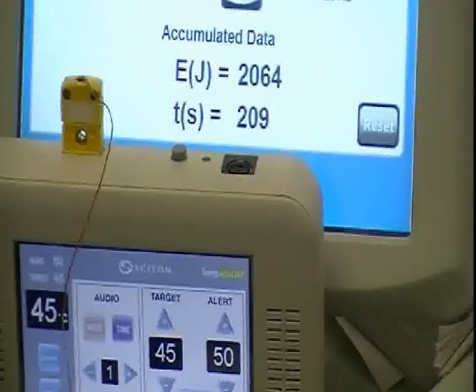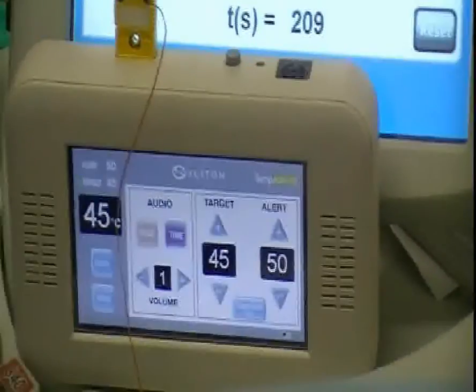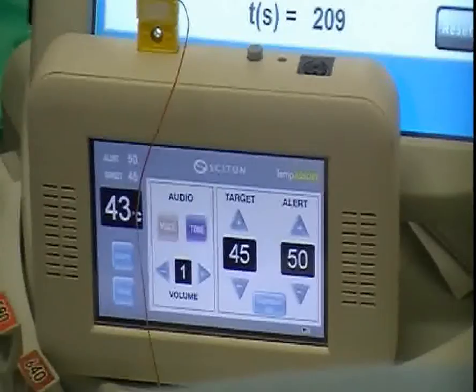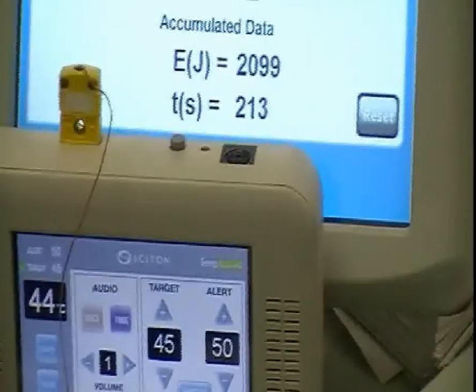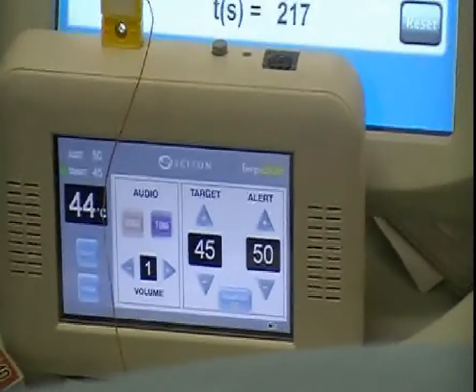You can see that I've roughly delivered 2,000 joules to the left side. I'm moving the temperature around now, and the temperature is roughly already 45 degrees, which is my end point. So if I deliver a bit more energy, you can see that my target temperature has been met in the dermis at 45 degrees.